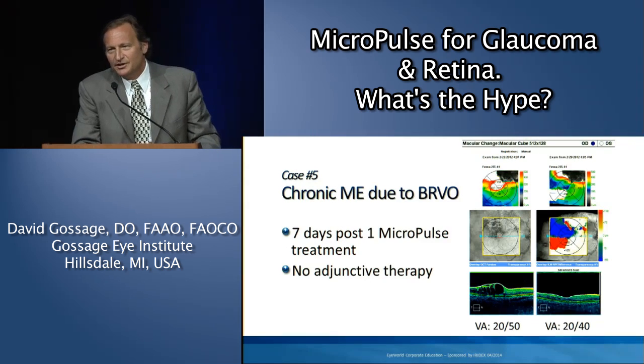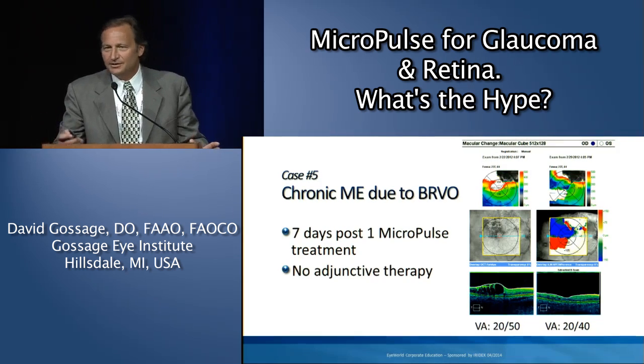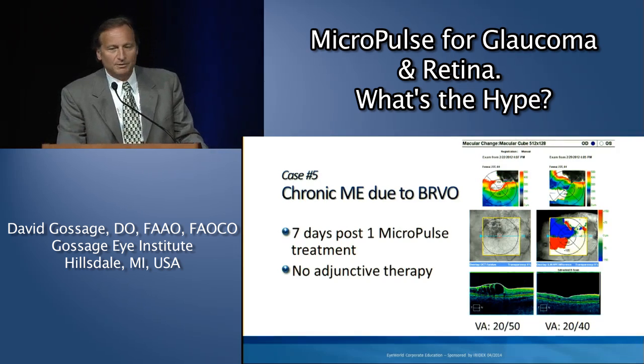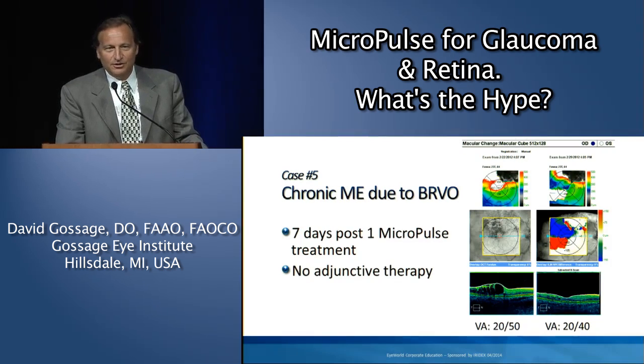Now the interesting thing is I never see the patients back in a week, but this patient came back to my office 1 week later and said, my vision's better. And I thought, okay, this is psychosomatic. The patient just had laser done. They're thinking, yeah, their vision's going to be better after having laser done. But this is 1 week after MicroPulse. Now, you're not going to typically see these effects occur, but in this case, it just happened. This patient had no adjunctive therapy. Visual acuity is still down, 20/40, but definitely resolution of quite a significant amount of that edema.